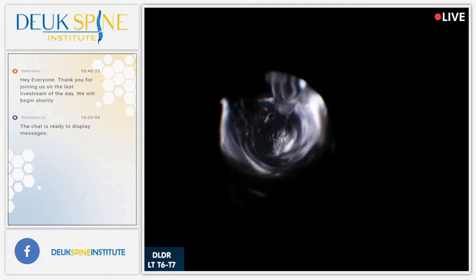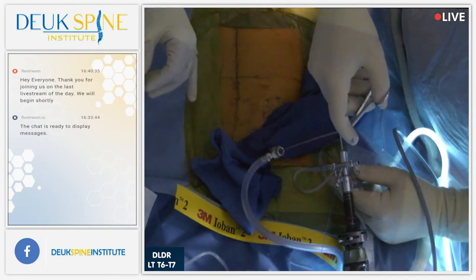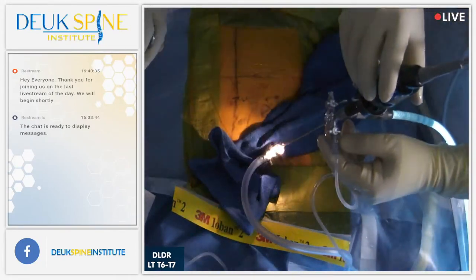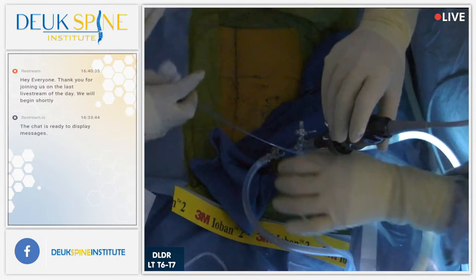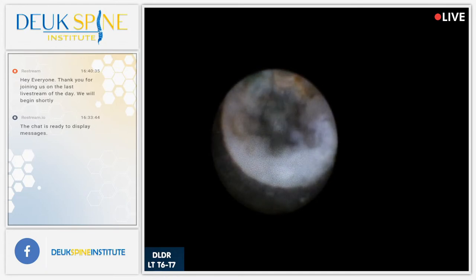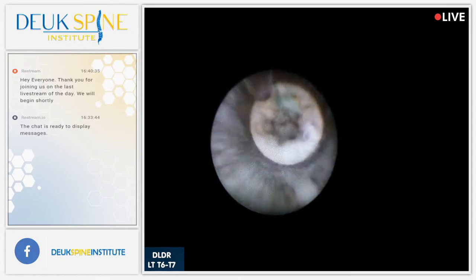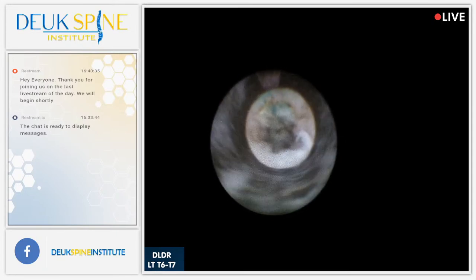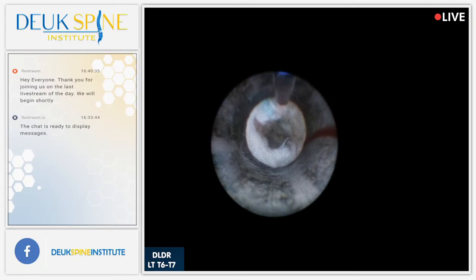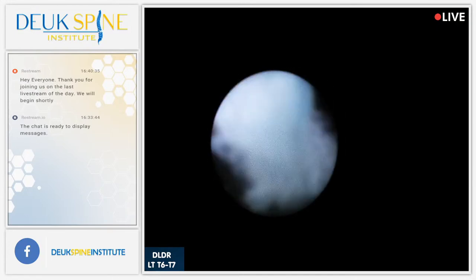Grabber. This irrigation is weak. That's a little bit. Yeah, that's your laser. Come on. Okay. That's not great. See, the blood is starting to clog the field.